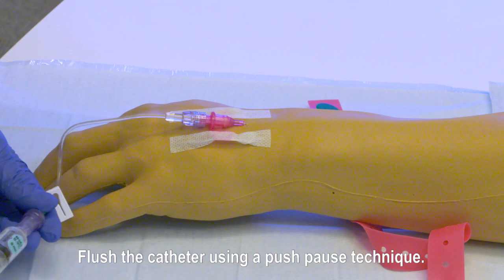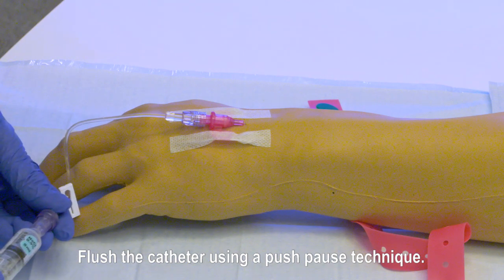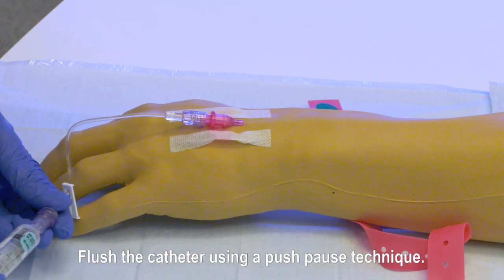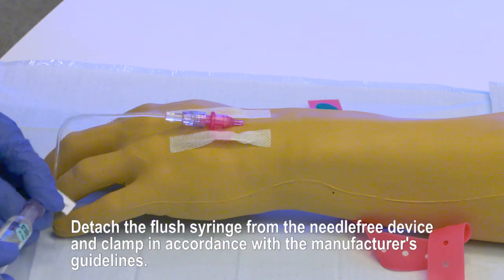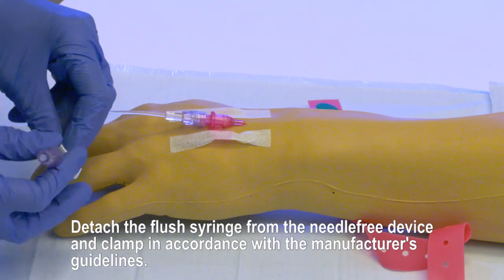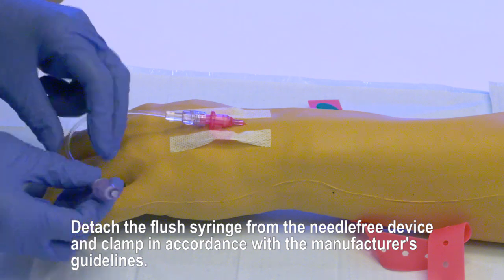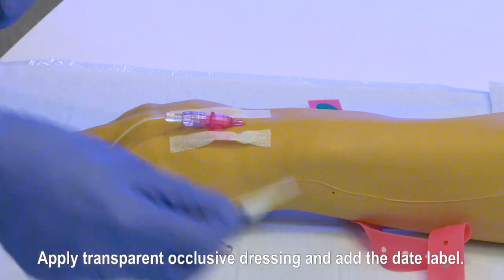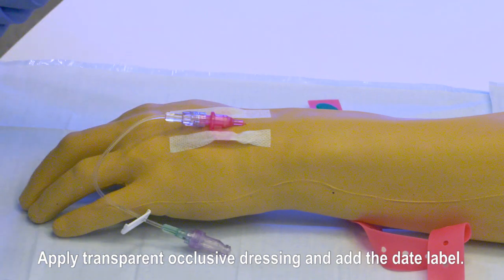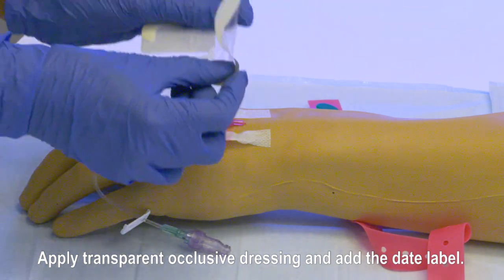Flush the catheter using a push-pause technique. Detach the flush syringe from the needle-free device and clamp in accordance with manufacturer's guidelines. Apply transparent occlusive dressing and add the date label.